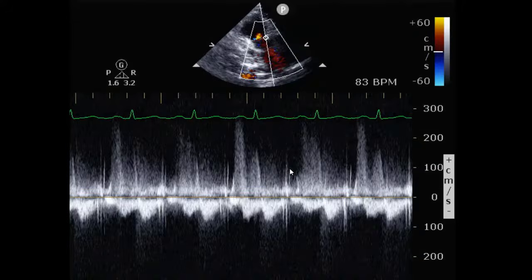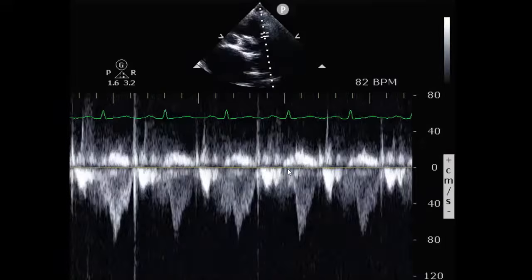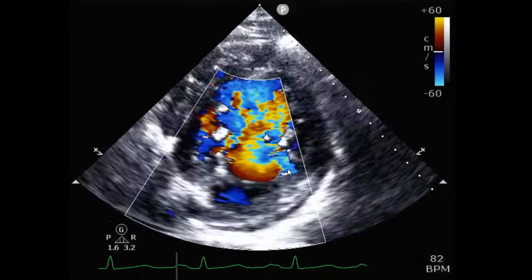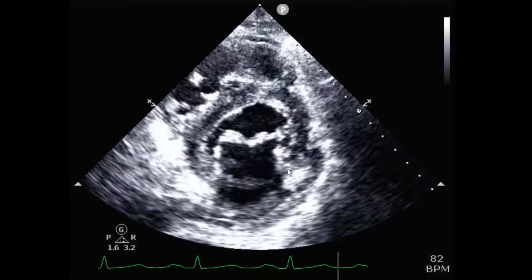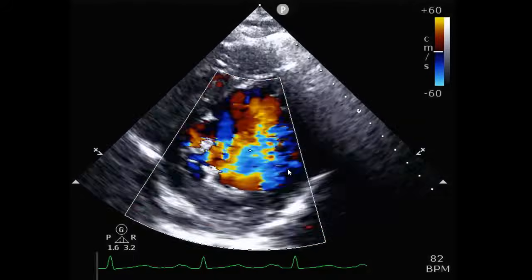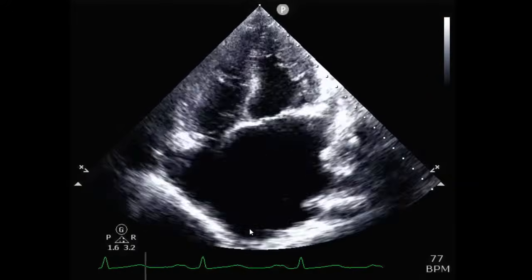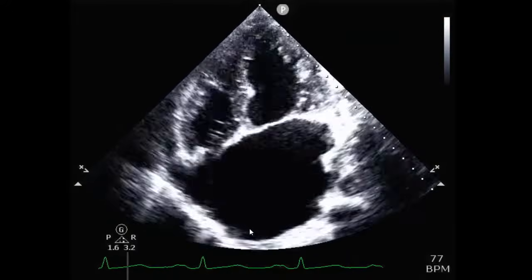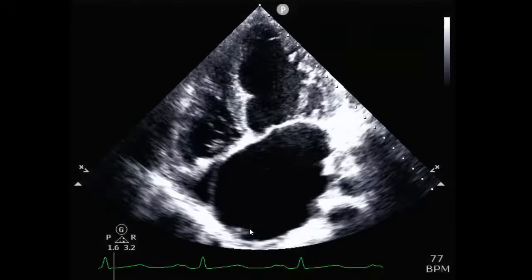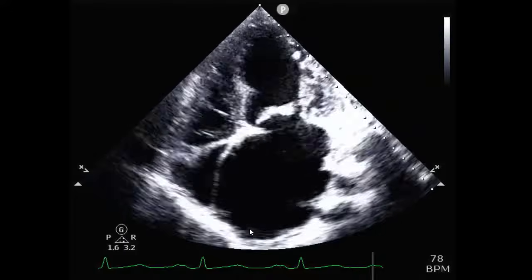Moving on to the short axis view of the heart, to the key images, which include the mitral regurgitation on short axis, first without color, then with color. Regurgitation jet seen prominently here. I'd like to collect images at this time in addition to looking at the pictures, so I can have the images consolidated in one place and I can do my calculations easily that way at the end.